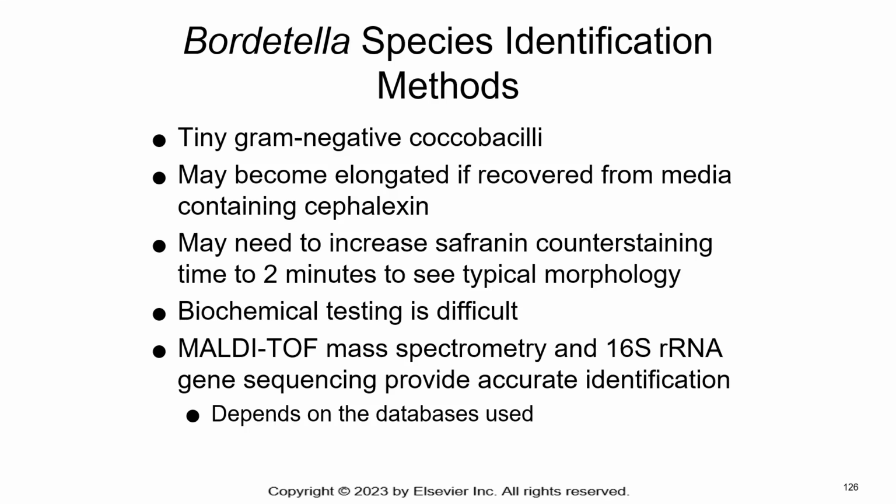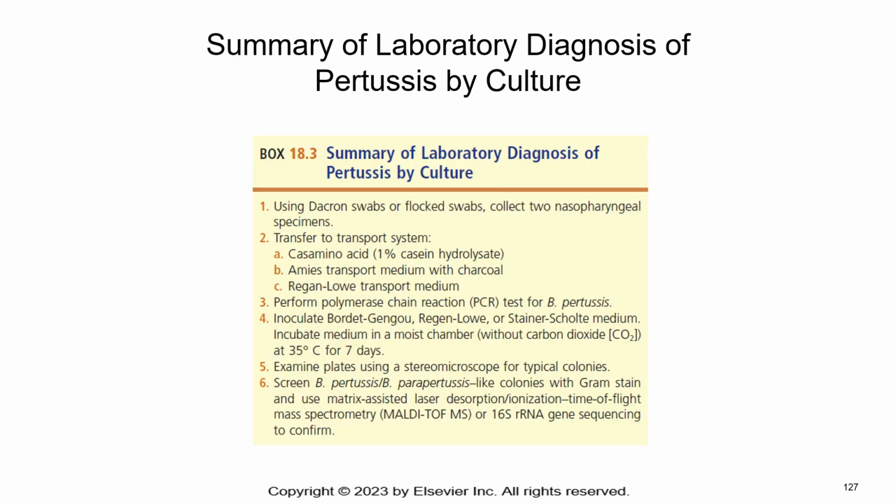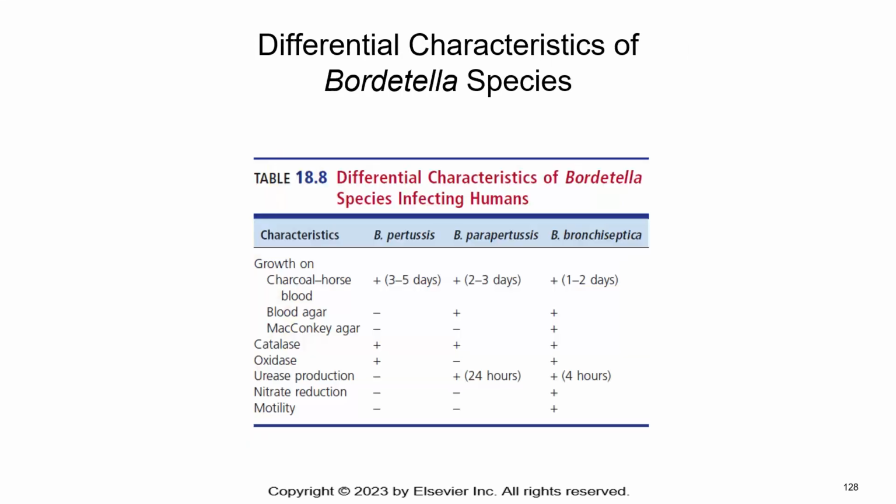There are various methods for identification. MALDI is one of the most sensitive if you can manage to get it cultured. And here is a summary of laboratory diagnosis of pertussis by culture, and differential characteristics of Bordetella species.